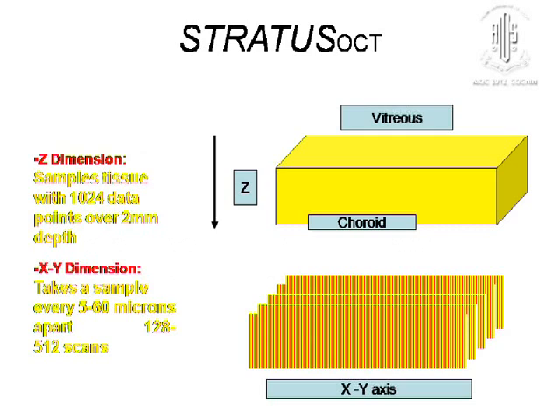So you will have a very good picture of the optic nerve head and also the retina and the various layers of the retina. The main advantage is that you can quantify the retinal fiber layer thickness when compared to the HRT. HRT gives you just a topographic analysis of the retinal fiber layer, but here you can have a quantification of the retinal fiber layer, as well as three important areas: the optic nerve head, the macula, and the retinal nerve fiber layer thickness.